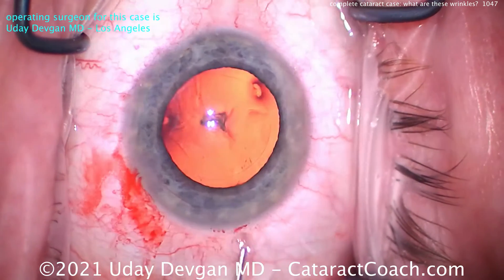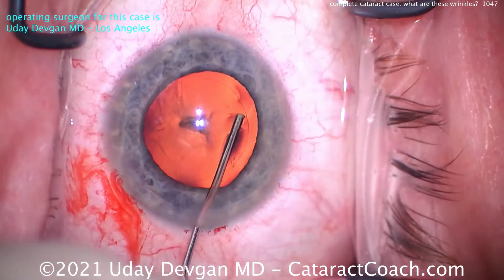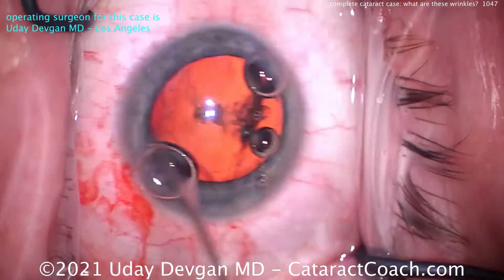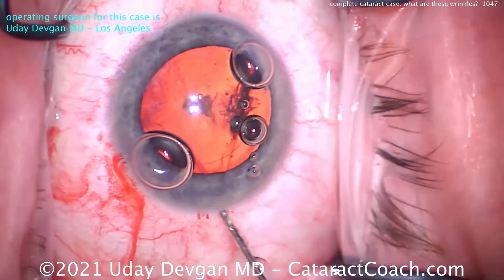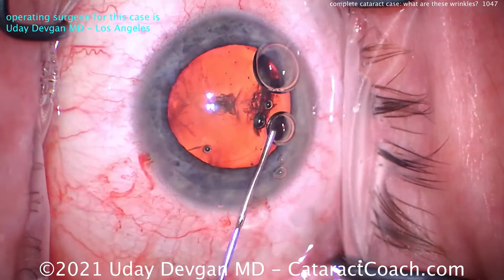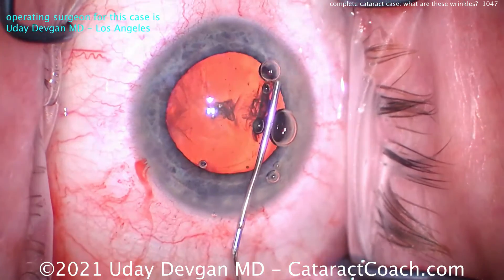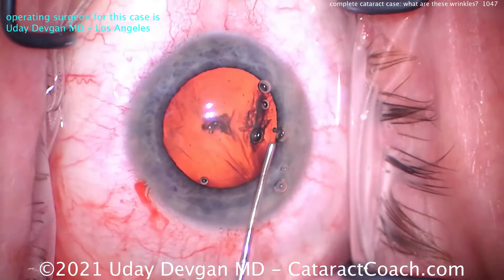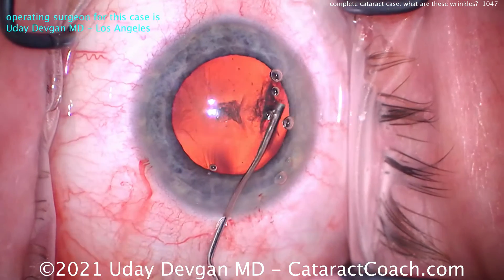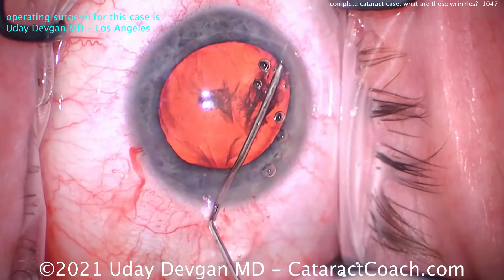Now let's do some hydrodissection. This is a pretty efficient case — looks like we're clocking in at under six minutes. Again, not about speed, about efficiency. Let's get those bubbles out because those are annoying; we don't want bubbles in the anterior chamber. Slow and steady on the hydrodissection.